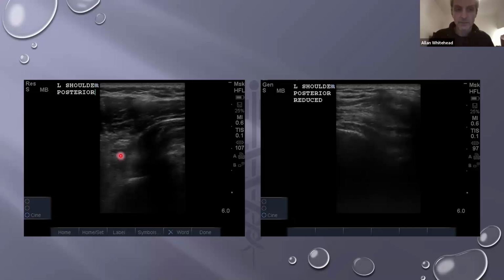And so when you're lining up the probe marker, you want to make sure that the screen actually is visualizing to you the same as if you're looking at the patient. You don't want to be having the orientation on the screen opposite to the way you're looking at the patient. So you should always have the probe marker making the screen and the patient look one and the same. So on this left shoulder, coming from behind, lateral to the left as we look at the screen, that is going to be the humeral head more to the left, and the glenoid fossa more to the right.